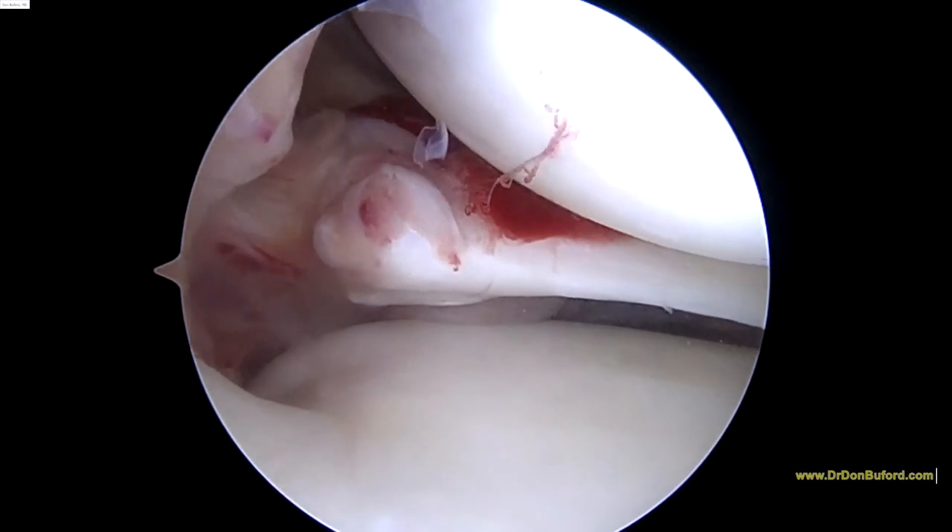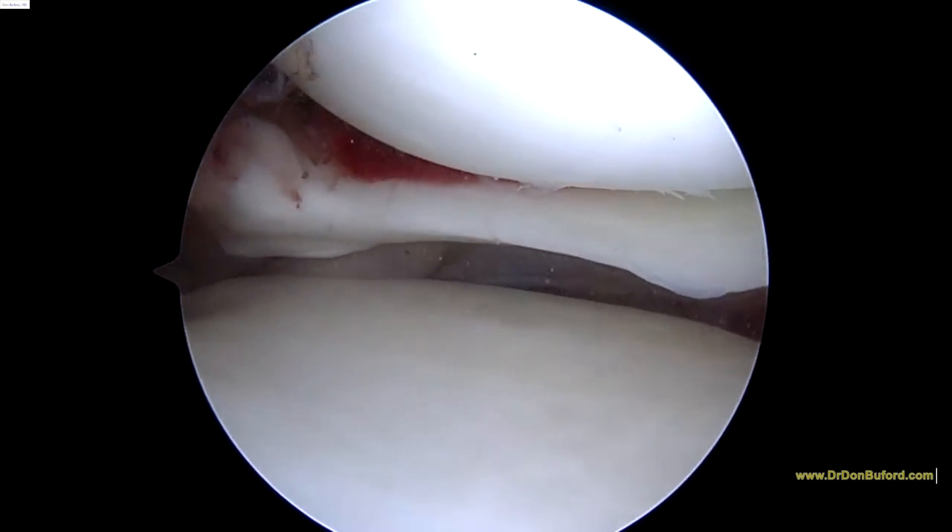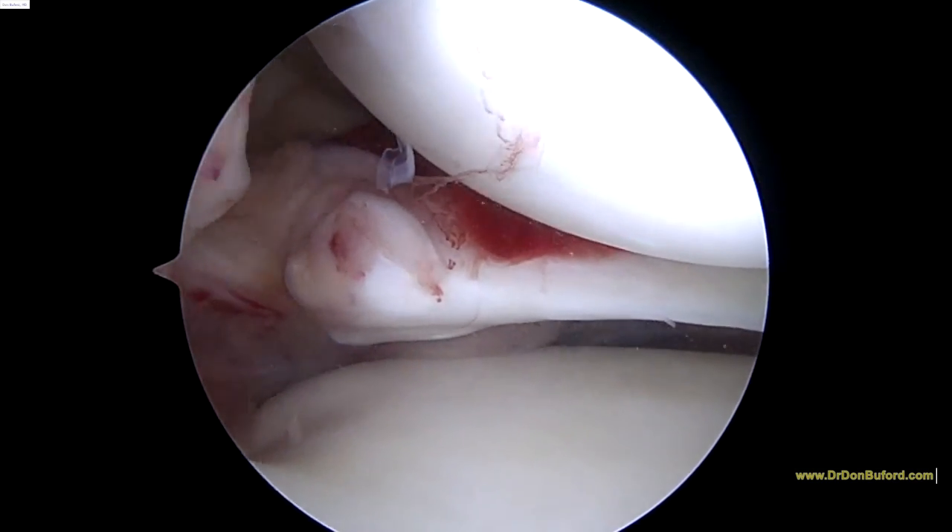So now we're done with the medial meniscus. We put in a total of about two cc's, both in the capsule and in the meniscus itself.